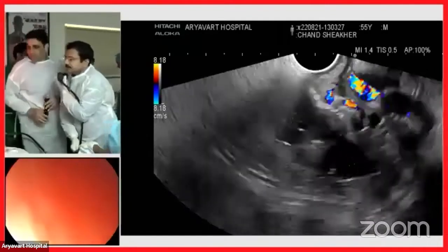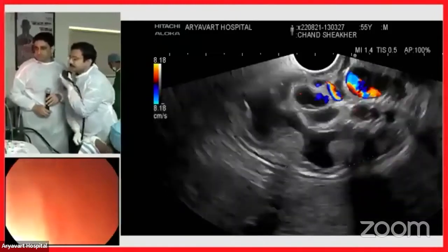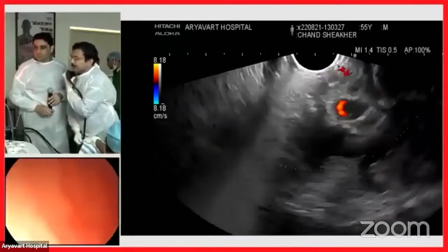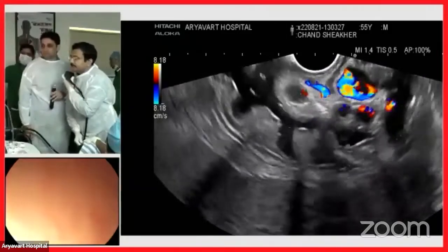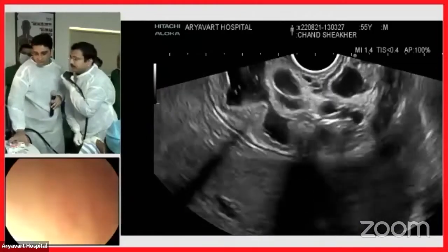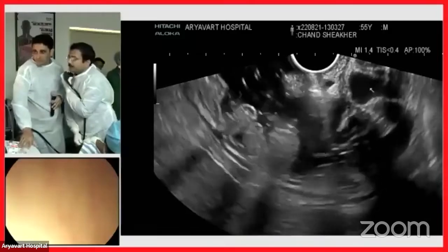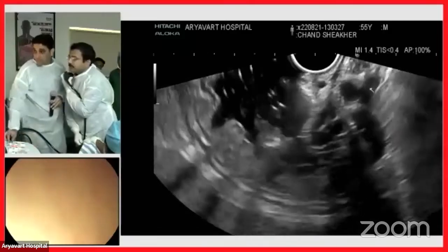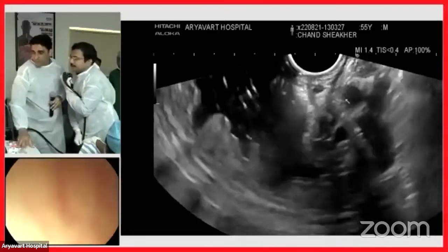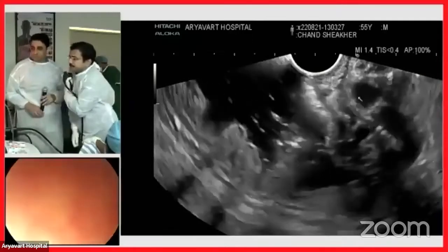Here you can see these are the varices. There is a small-size honeycomb pattern. This particular vessel you can see outside is basically a collateral. You can see the gastric wall on ultrasound, which Dr. Kapil is pointing out now — that is the gastric wall on US. This particular vessel is lying outside that.